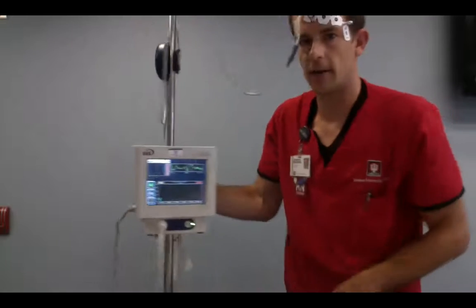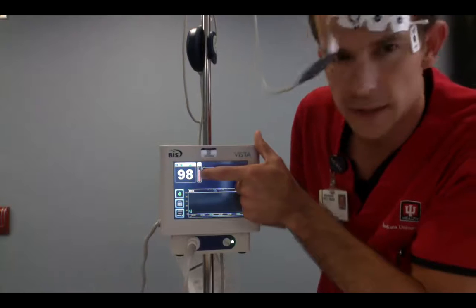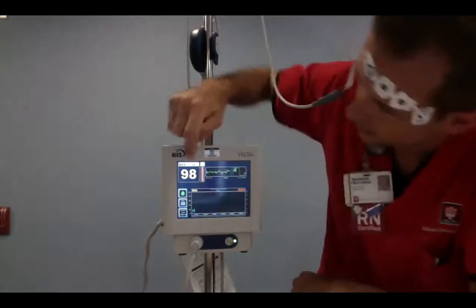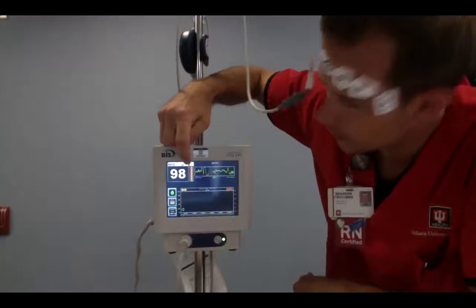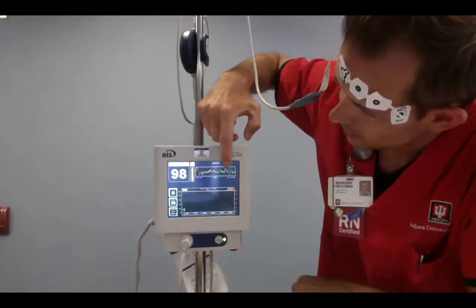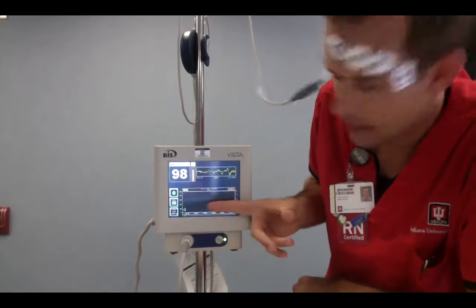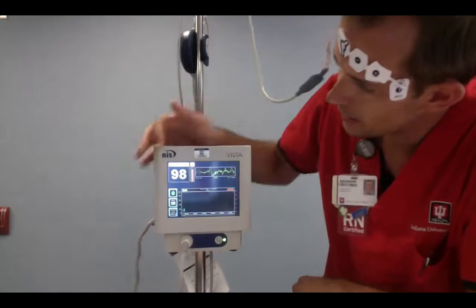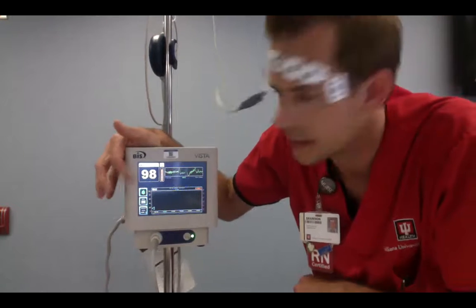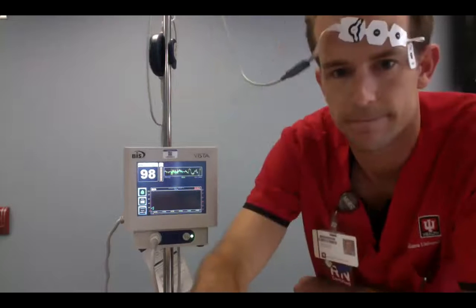So we'll see this fire on. We'll see that I have a lot of interfering muscle activity, and we don't have a great signal because I'm really moving around a lot, probably creating a lot of artifact. We see my BIS waveform in time. This will start to plot my BIS waveform over time. And then we see our number 98. We're going to want to titrate this and keep it between 45 and 60. And that's it.